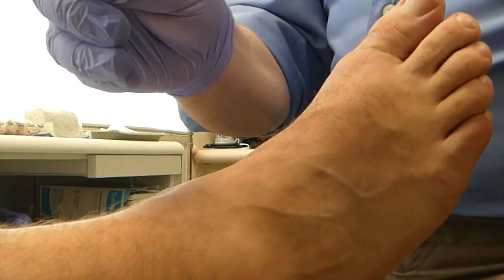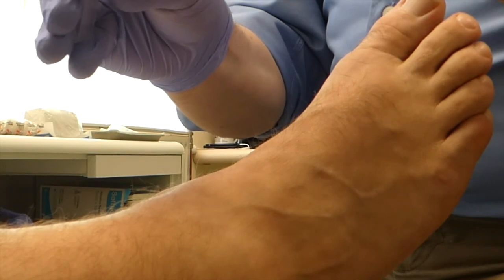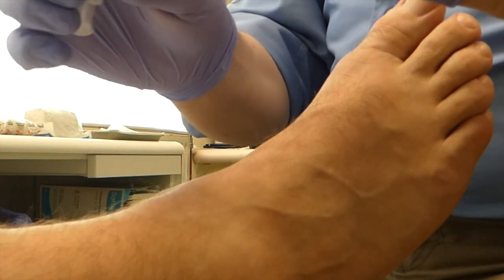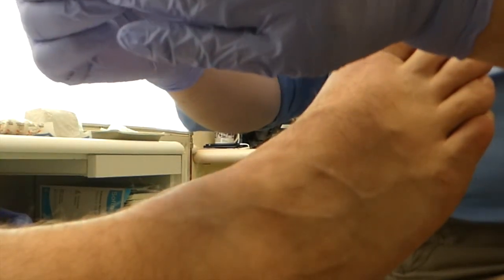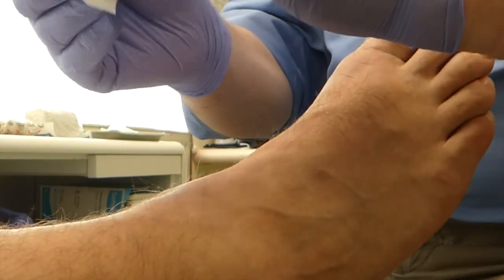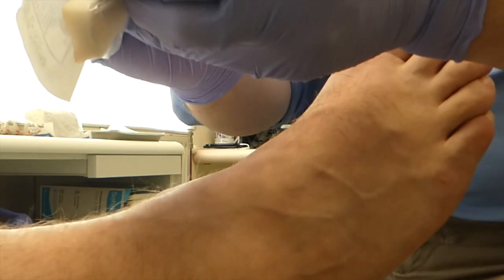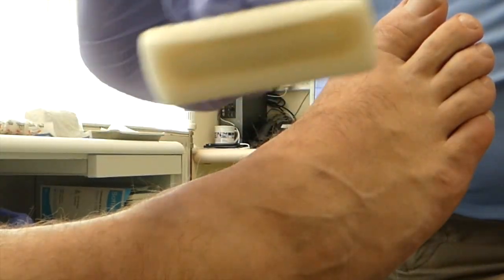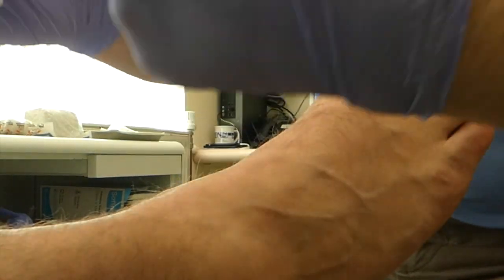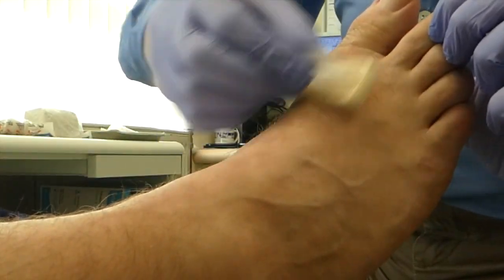Blue to inject with. You could use orange — blue is fine, particularly for tough patients like Nick, not his real name. So a bit of skin prep: these are the chloropreps — you'll see more of these in the videos. Little click and then just sets them going, and then we'll just do a little bit of skin prep.